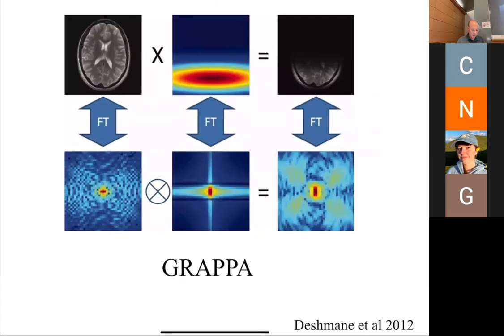Okay. And then we're going to end with one last thing to continue with this understanding of how the coils affect the recon, which is the other way of doing parallel imaging, what's called GRAPPA. It's based on the idea that if I have my object and I multiply by a coil sensitivity pattern, I end up with my object I times some coil sensitivity pattern C, right?